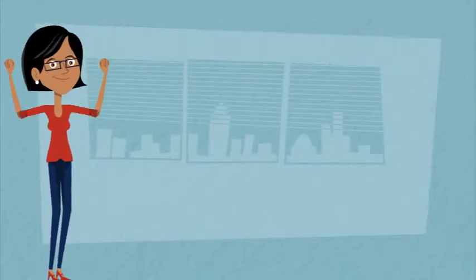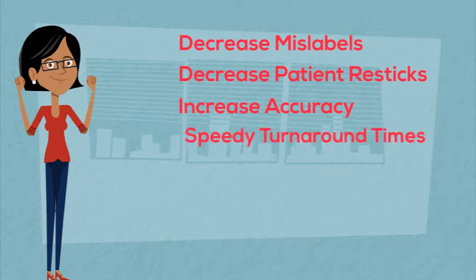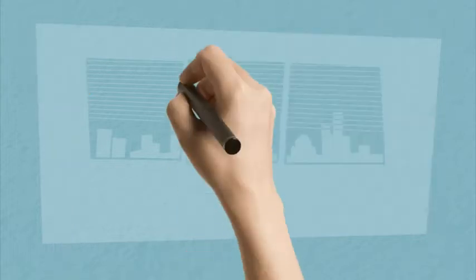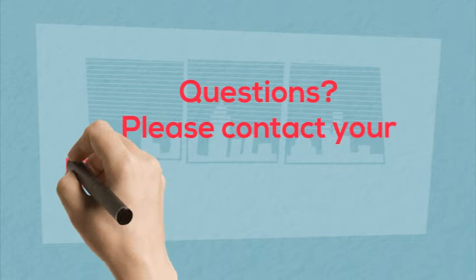Moving this documentation to EPIC will help decrease mislabels, decrease patient resticks, and increase accuracy and speedy turnaround times. With a shorter turnaround time, it could improve patient outcomes. Please contact your manager or your clinical education specialist with any questions.